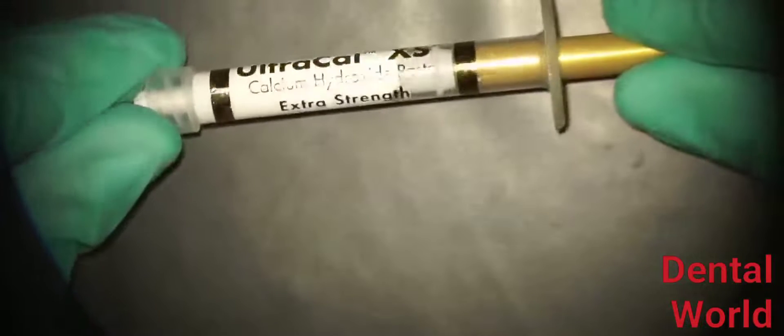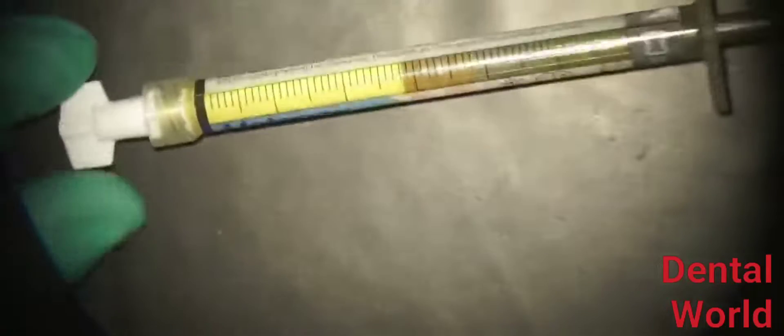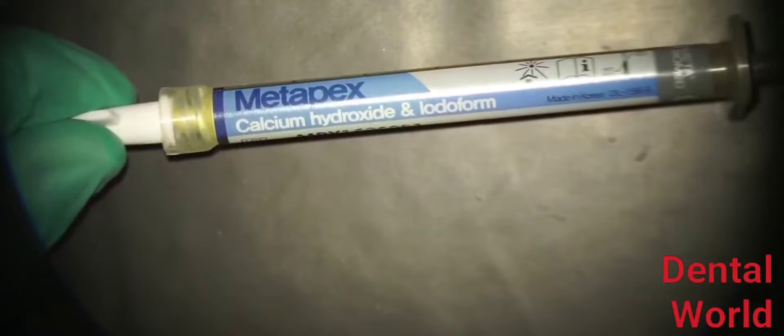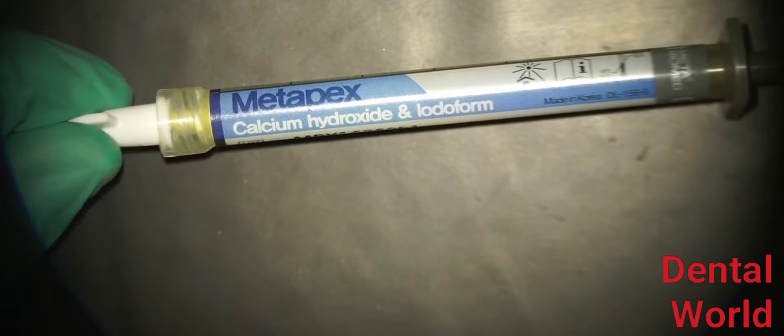Apex-Cal from Ivoclar Vivadent and Ultra-Cal from Ultradent, both of which are aqueous solutions of calcium hydroxide. For open apex cases, we use something called Metapex, which is calcium hydroxide mixed with Iodoform. This is much thicker than the other forms of calcium hydroxide, so you don't want to use it in regular cases or in narrow canals because it just doesn't go through.